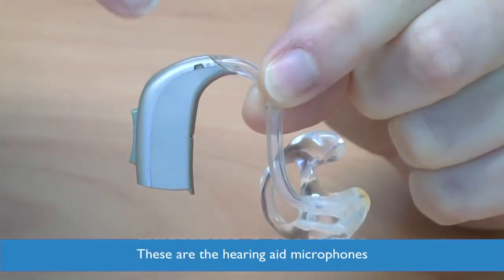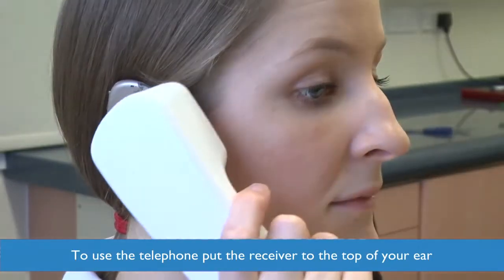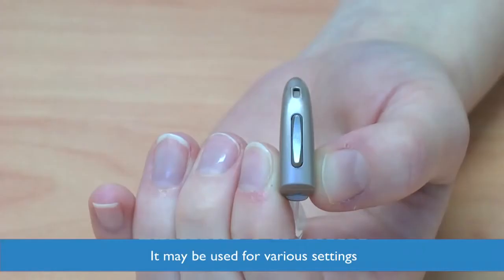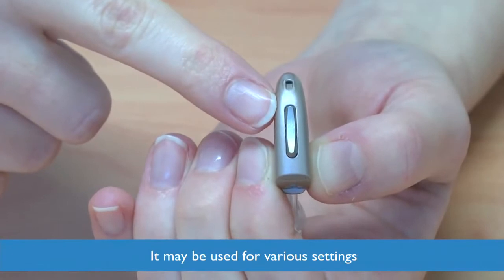These are the hearing aid microphones. To use the telephone, lift the receiver to these microphones on the top of your ear. This is the button on the back of your hearing aid. It may be used for different reasons.